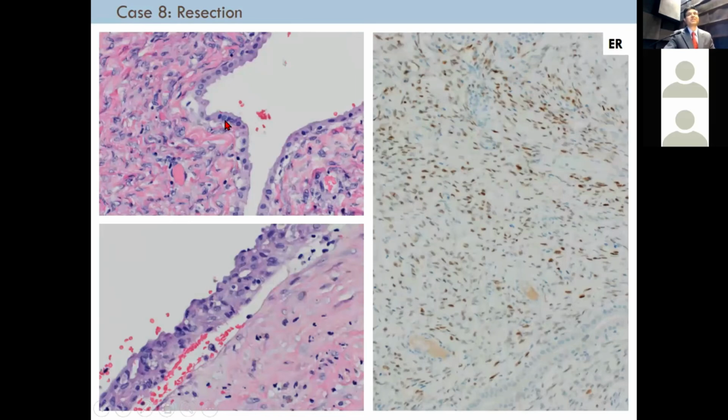This is a cuboidal, what they describe as biliary type of epithelium. This was the predominant lining that we saw. There were a few areas that showed a stratified lining, with cells that showed mostly a reactive look, and I think this corresponds to the atypical cell groups that we saw on the cytology. No mucinous epithelium was seen in this case.